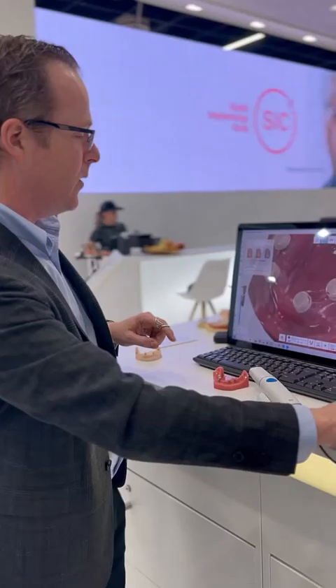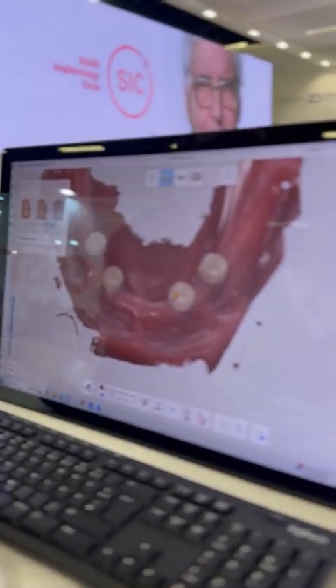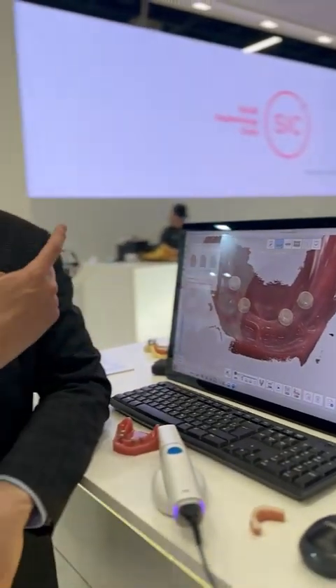And that was the entire scan everybody. Scanning with locator digital scan bodies with the Medit i900 is super simple. Now what's great is I can go ahead and take this scan and simply email it or send it to my dental laboratory. They can 3D print that model and that model can now go into either a digital or analog workflow.